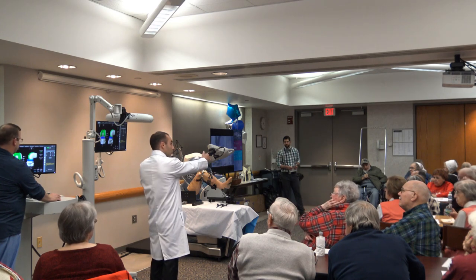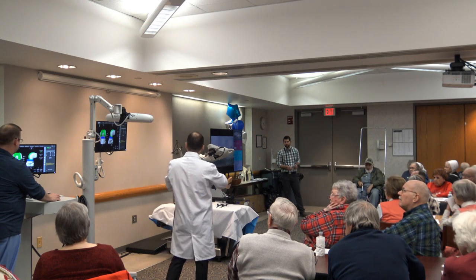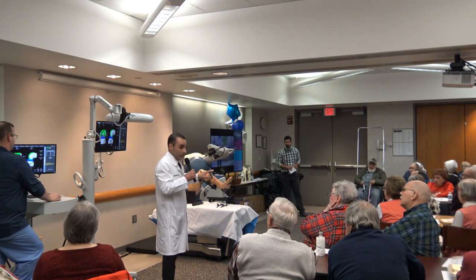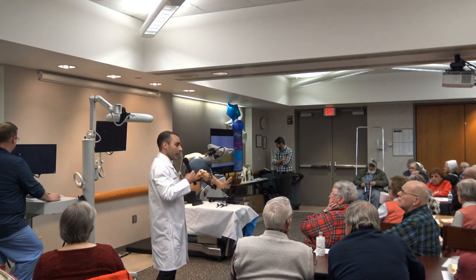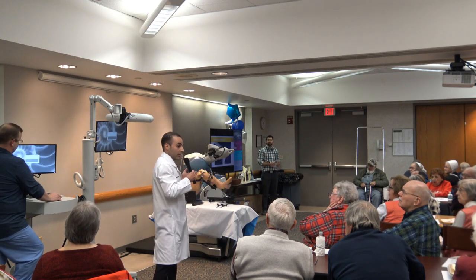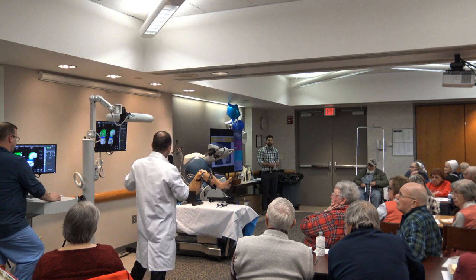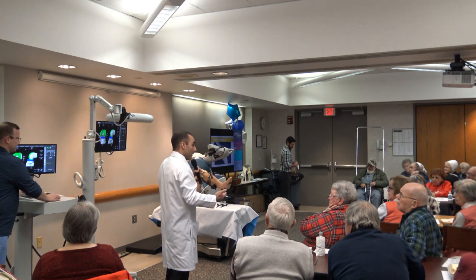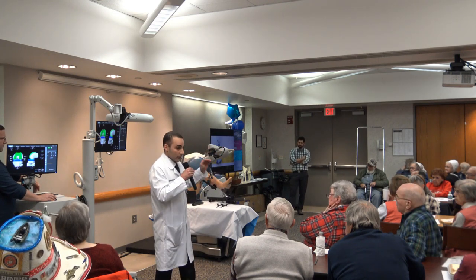The benefits of the robotic arm are that it makes very precise cuts, and it gives us a defined field so that we only cut within the margins of the bone — we can't accidentally cut outside those margins. So we don't need extra retractors, which minimizes soft tissue damage, and we don't need to dislocate the knee as long to see what we're doing. Once we make our cuts, remove the robot, and put the implants in, we can check our work and make very precise adjustments with the robot if needed.